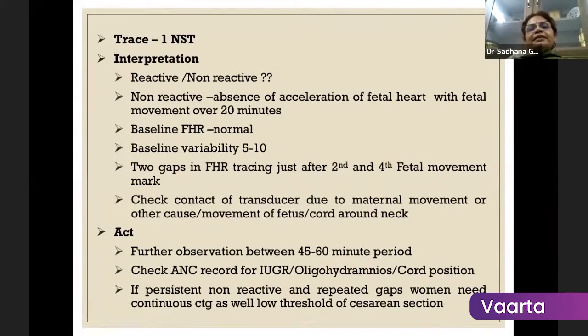So as Mukta says, baseline variability is less and there has been two things. There has been loss of contact or sometimes a cord around the neck with the compression. We sometimes get that loss of gap. So like Sanjay says, we have to see whether this patient is already having IUGR or oligohydramnios in ultrasound. What is the cord position? And in this situation, we have to be extra careful.